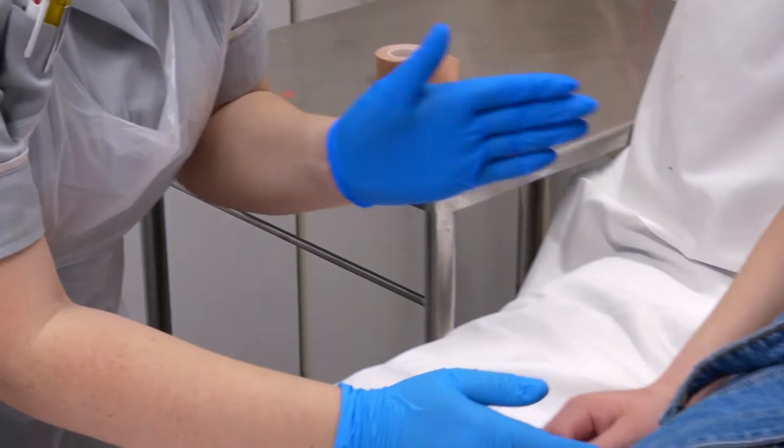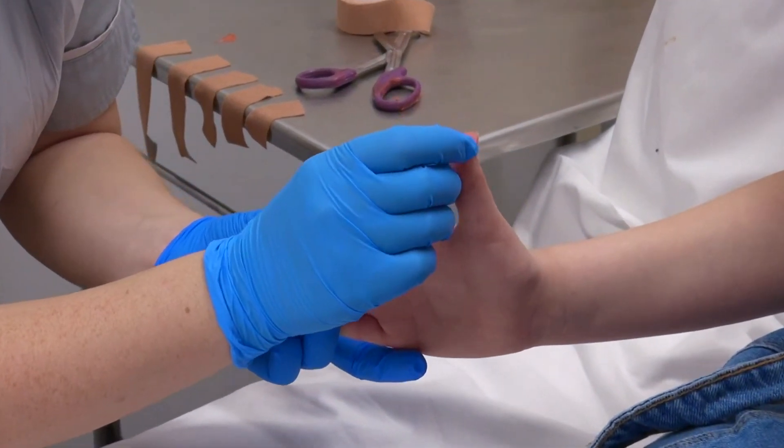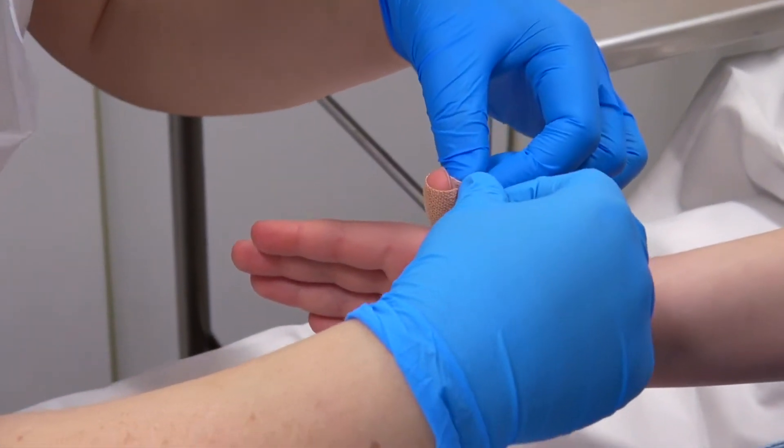Have your hand out forwards. Fingers nice and straight, and then thumb up nice and straight. And just want to make sure they're just touching.